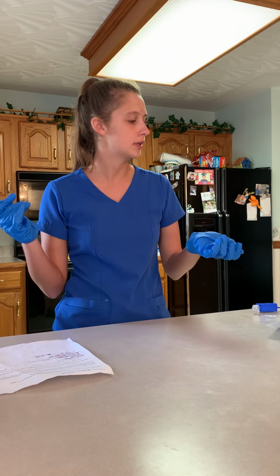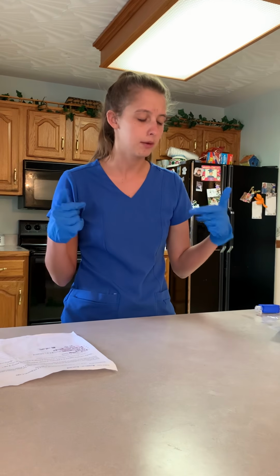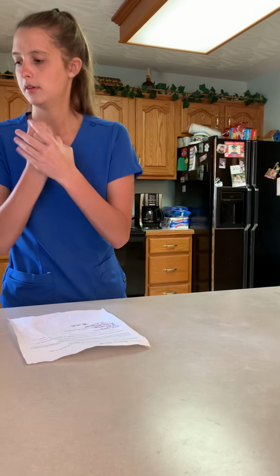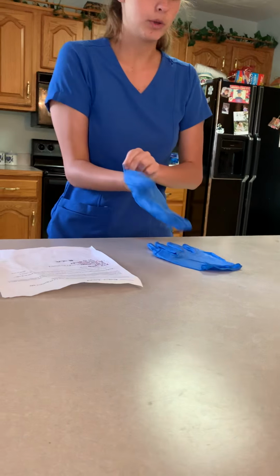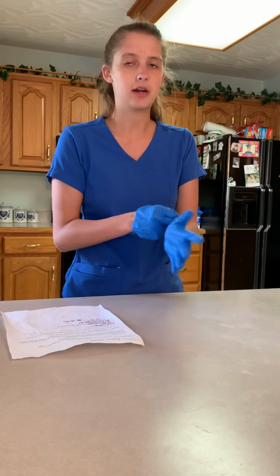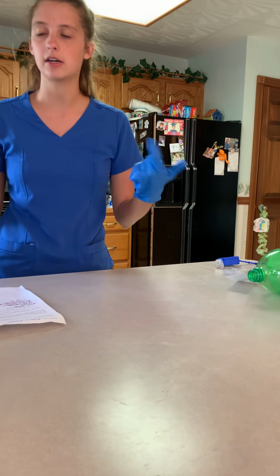I did notice that we had some distension in the bladder. We were assessing for urinary retention, so we're going to continue on with the procedure. I'm going to remove my gloves, discard them, and wash my hands. Next, I'm going to get another clean pair of gloves, and we are going to assess the patient to see if he needs any pericare done before the procedure. We are assessing the patient, and there does need to be pericare done before the procedure.